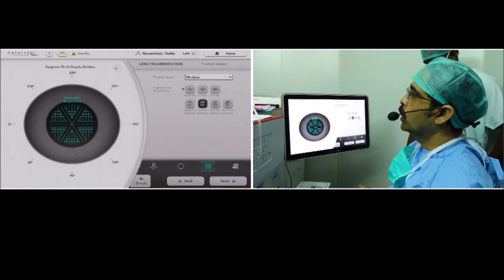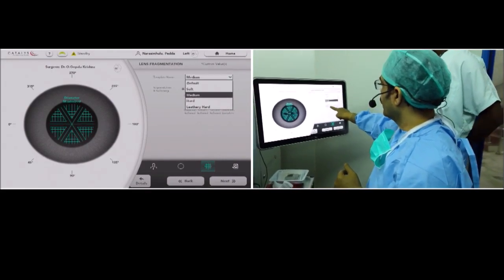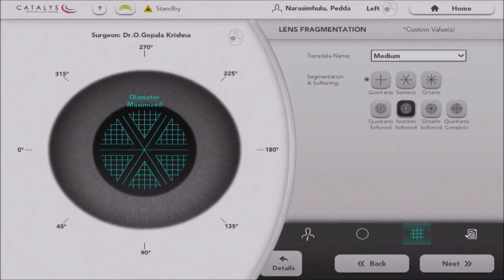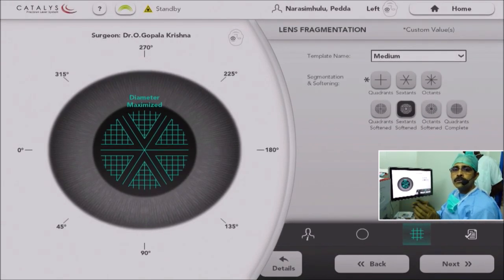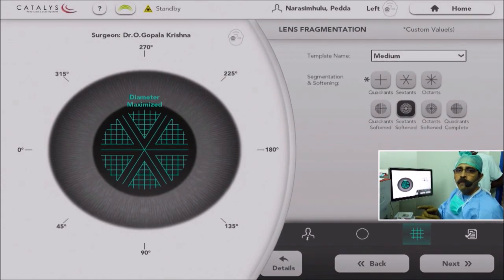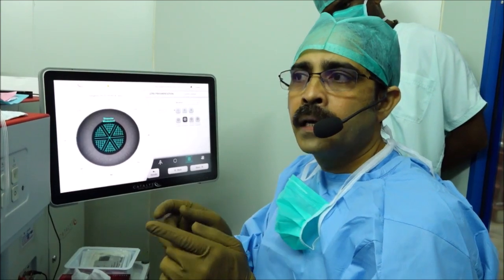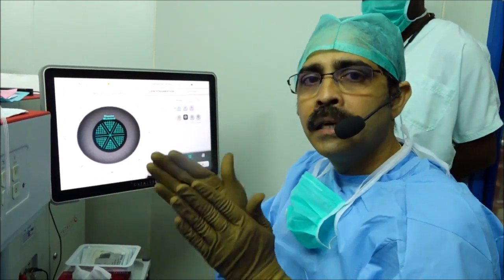Can we use this for grade 3 and grade 4 nucleus to crack? Yes, we can use it for grade 3 and 4. On the monitor you can see I have options: soft, medium, hard, and leathery hard. In this case it is a medium cataract. The problem with hard nucleus is there are some concerns about grade 4 or black or brown cataracts — it may not be very useful. But even in those cases, I can at least get a crack into the nucleus fragmentation to make chopping easier. The laser creates a plane whereby chopping becomes much easier. The leather lens fibers will not crack easily with mechanical chopping techniques, but this laser will assist in getting good clean cracks even in grade 3 or grade 4 cataract.